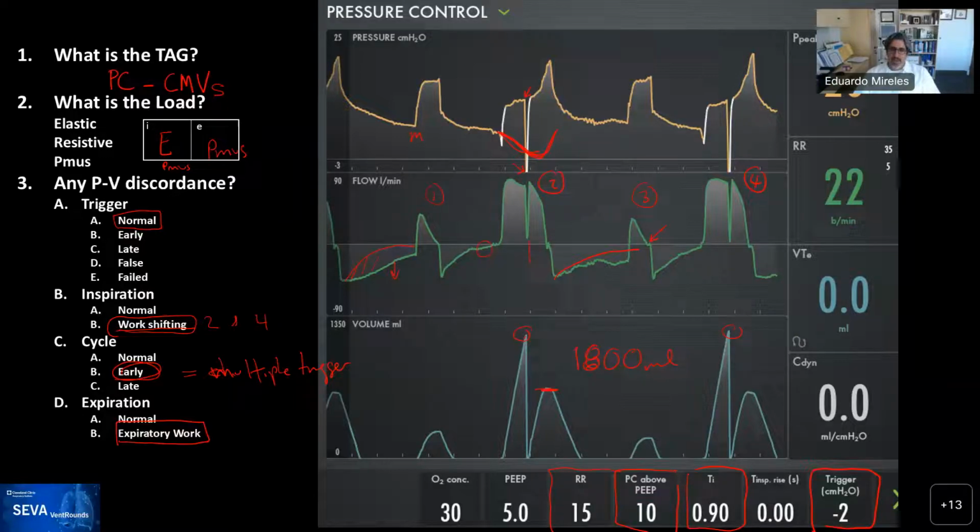And so I think this is eminently a technological solution from the ventilator companies: to detect the desynchrony, detect double triggering, and alarm that the tidal volume is high based on what they're seeing.